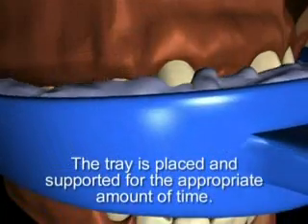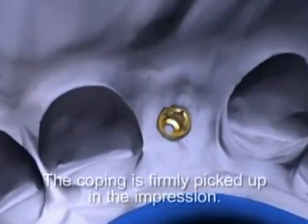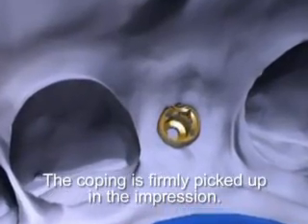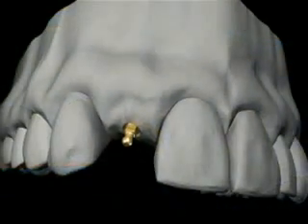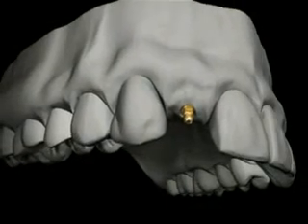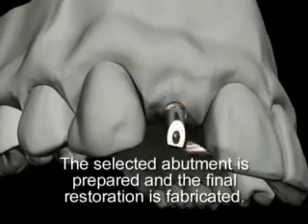A monophase impression material is appropriate for this procedure. The tray is placed and supported for the appropriate amount of time. The final impression is removed and inspected — examination reveals that the coping has been firmly picked up. Milo laboratory analogs are inserted into the impression copings, the working model is poured up, and appropriate Milo cement-over abutments are chosen for the restoration.